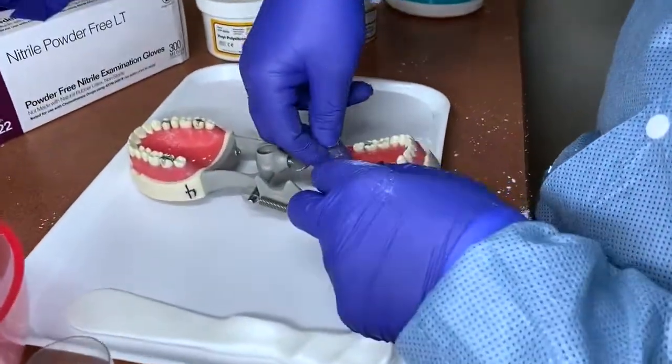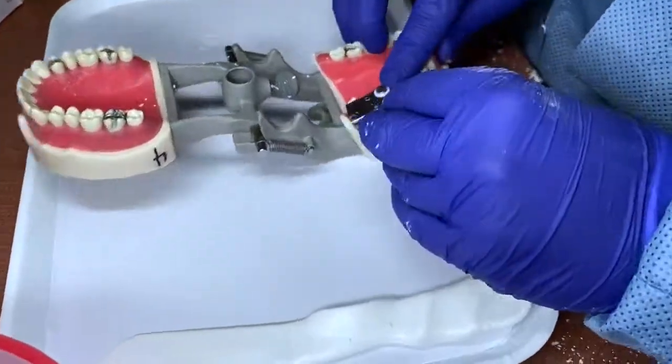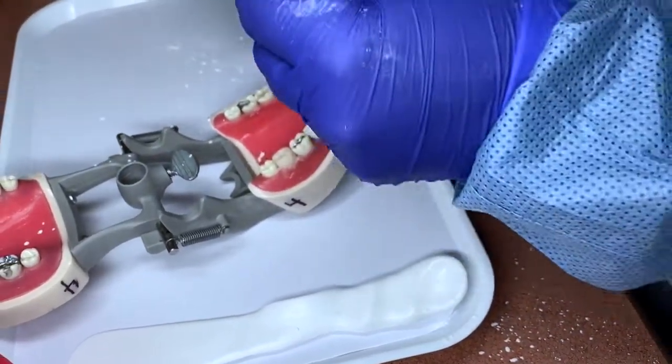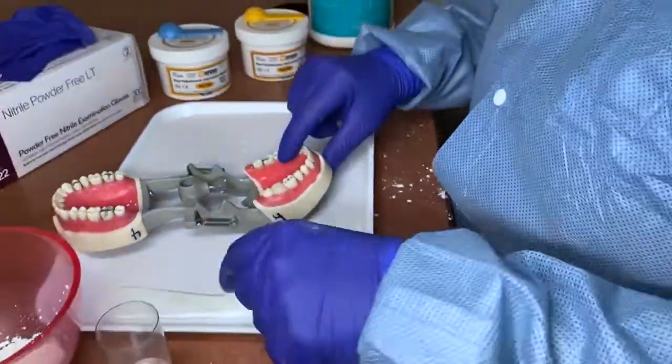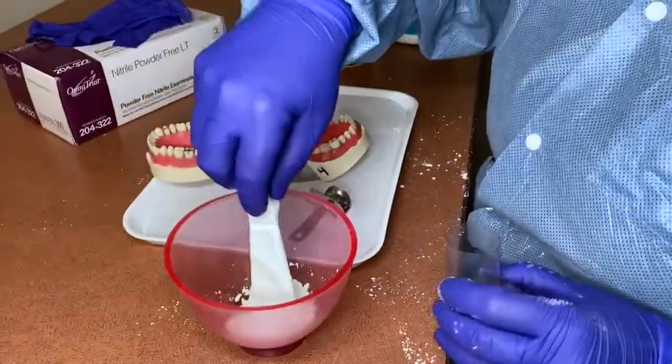She's trying in the tray to make sure it covers the teeth she needs — it covers three teeth, although we're only doing one. Once she's confirmed the tray fits, she's going to mix the alginate.